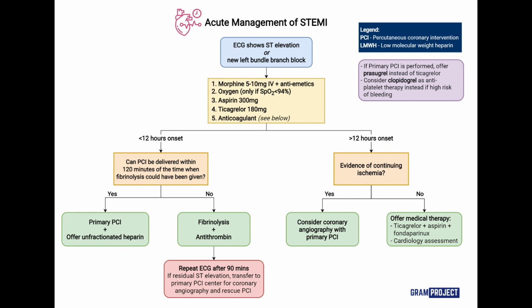Well, we've kind of built a practical framework, haven't we? Start with the grid, the math, the squares, the rate. Then check the conduction pathways, PR interval, QRS width, P wave shape. Then zoom in on those critical ST and T wave changes that signal ischemia, injury, or those dangerous electrolyte problems like potassium shifts. And the real power here is linking that electrical map directly to those urgent clinical decisions. Seconds really do count, and the ECG is often your fastest guide.